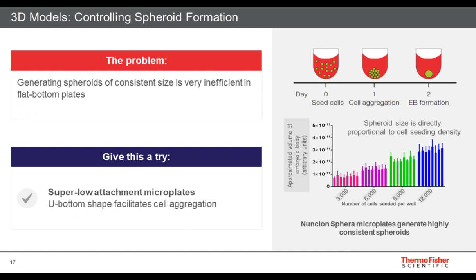This is meant to illustrate the last line. Traditionally, when I first started culturing stem cells or forming embryoid bodies from stem cells many years ago, one of the ways it was commonly done, partly because it was cheap and somewhat effective, was simply to culture cells in static culture, but in vessels that were non-adherent, so that cells would not attach.